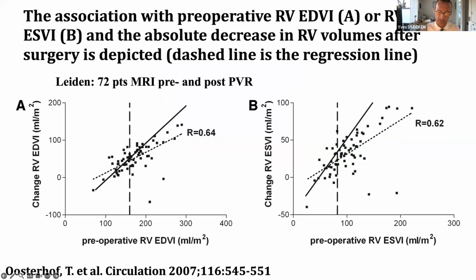There are other fields where 4D MRI can help us. And I give an example, tetralogy of Fallot. Tetralogy of Fallot, they have a leaky pulmonary valve after the operation, and the right ventricle increases in size. And we always try to look at what size. Is it too late to put a valve in to reoperate this patient? And that has been a big issue.